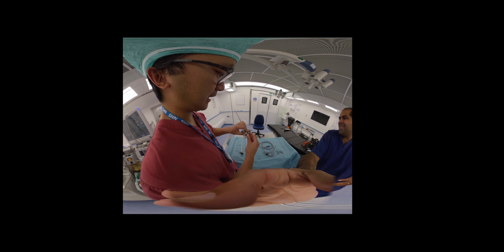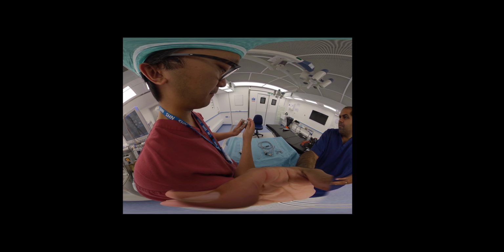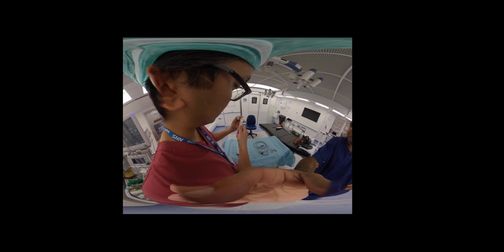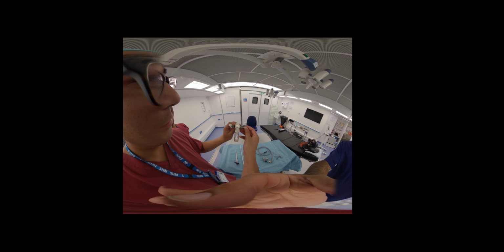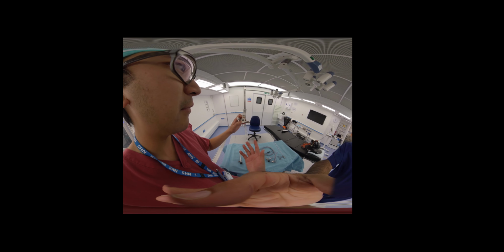Sorry, a base plate. This essentially, again, just pushes onto the back of the bronchoscope, and you have a variety of adapters to view. So you can either view through it, it's slidable, so you can view directly down the bronchoscope itself. You have an open port with a rubber bung on it. Again, you have to put the rubber bung on yourself, through which you can insert your optical grasping forceps, and you have a variety of other openings to be able to manipulate down through the bronchoscope.